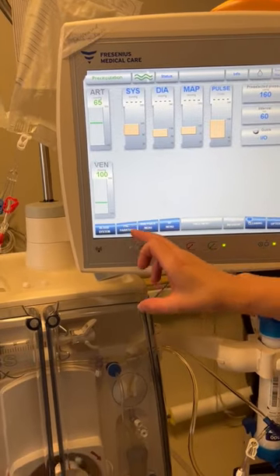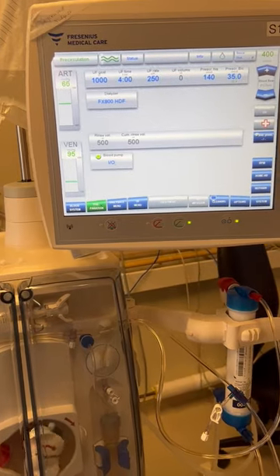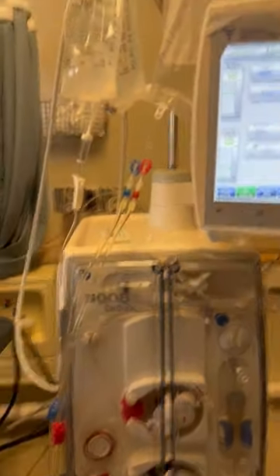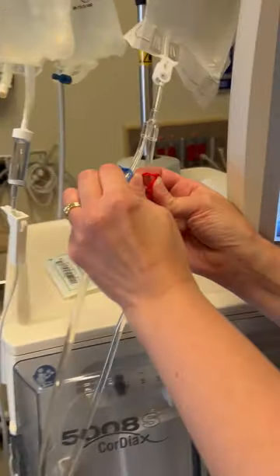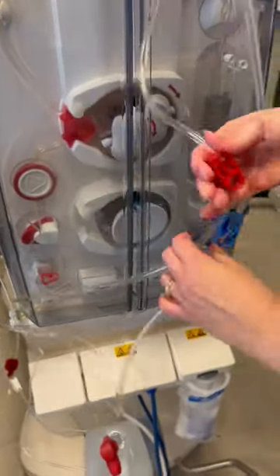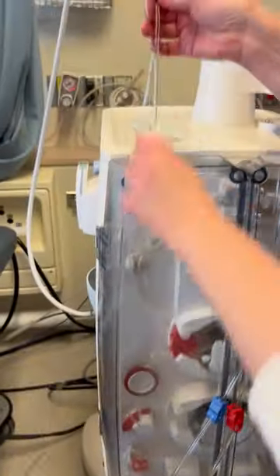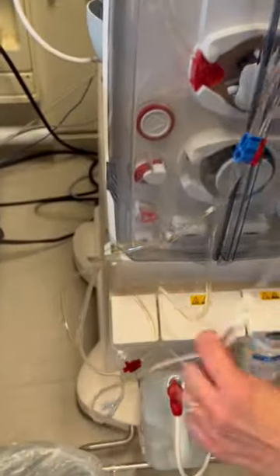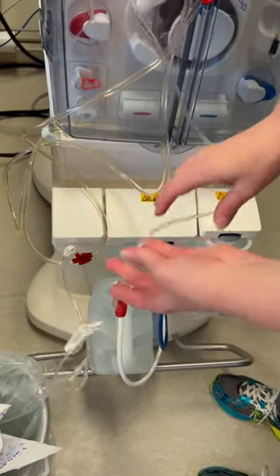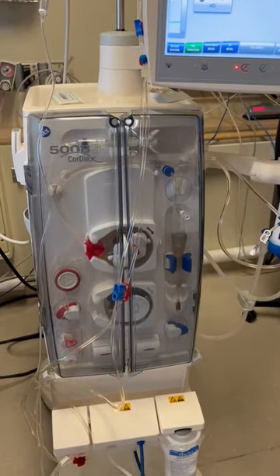We can go back to the pre-preparation screen and shut off our blood pump. Now we're going to want to clamp six clamps: two on the priming bag, two bloodline clamps, the saline T, and we're going to want to move that roller clamp down to where it's easily accessible when on treatment and close the roller clamp. Now we can go ahead to central venous line connection.